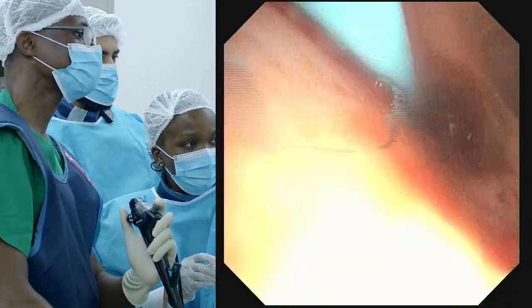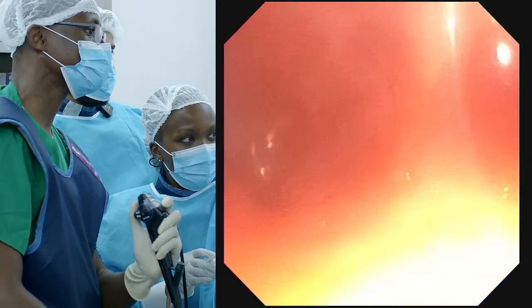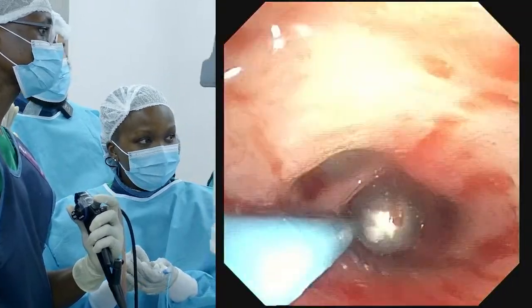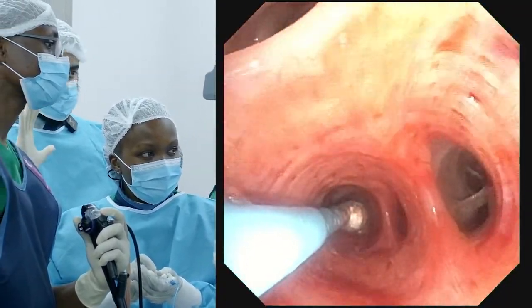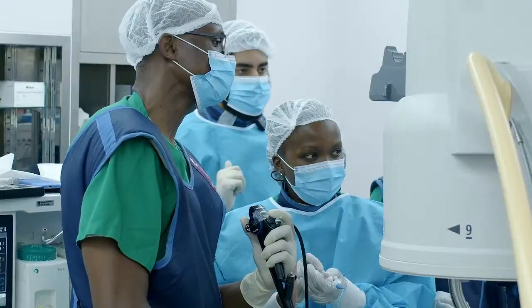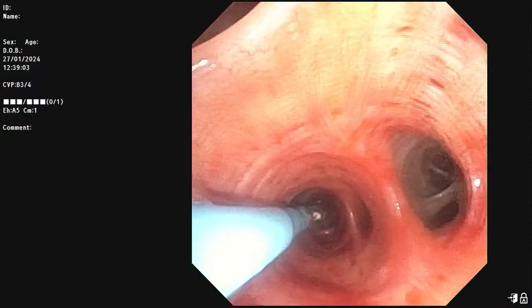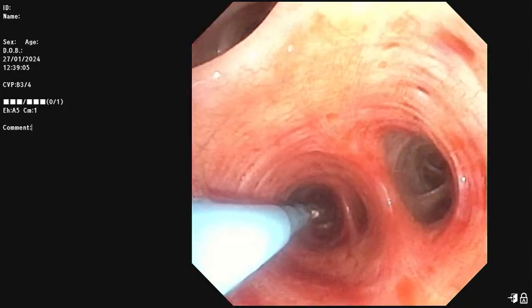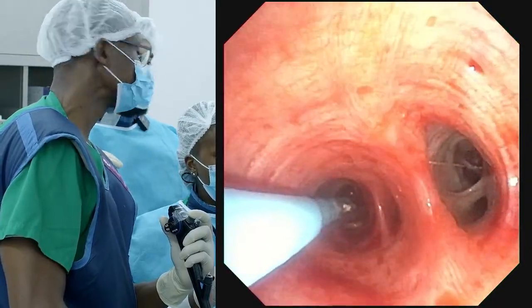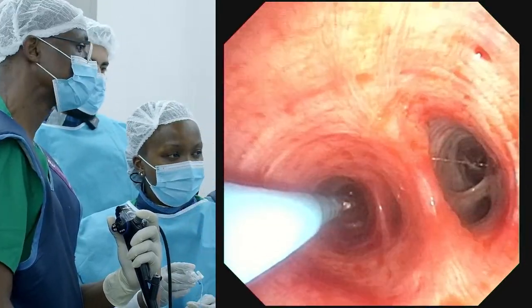So I think we should get our. Yeah, you're actually abutting the balloon. Now you can release, observe, and usually it's good. Wait for about a minute, because you don't want to have bleeding later and then you're stuck. So I think the last one. And you see, we like biopsying. I like going down. So this is good.